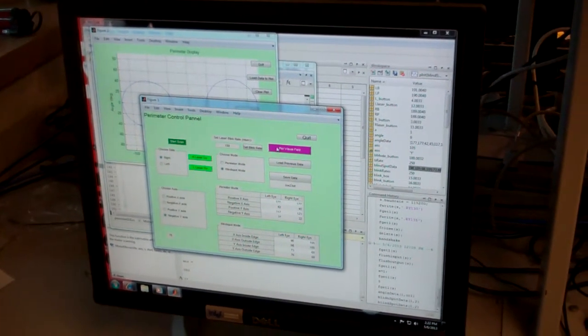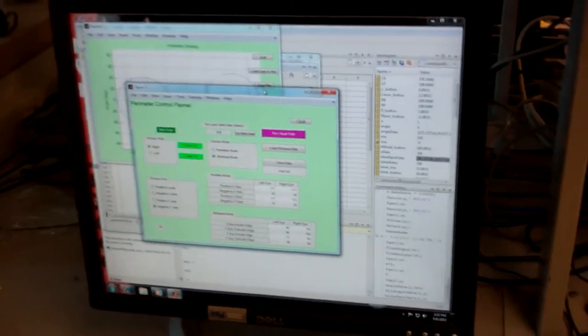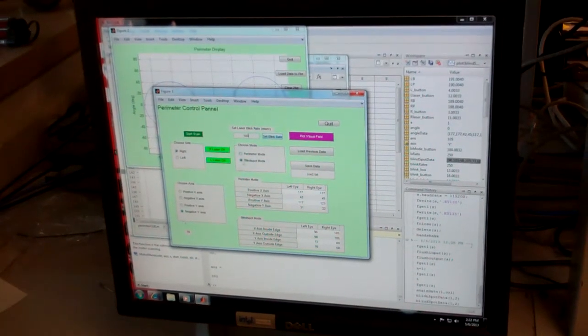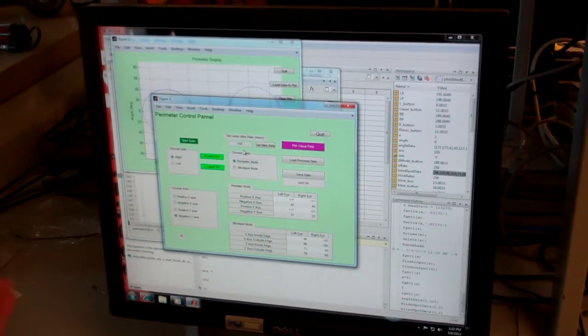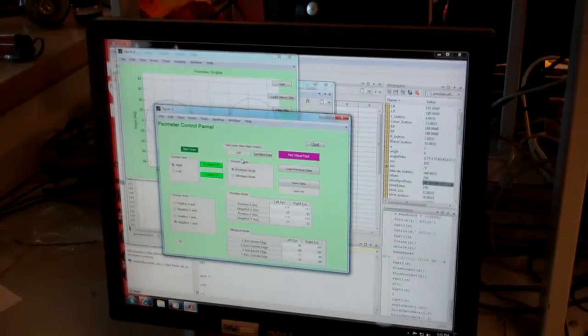Starting the data acquisition now with a blink rate of 10 times per second — this is the period in milliseconds of the blink rate. We're going to start with the right eye in perimeter mode. There are two modes: perimeter mode, which measures your peripheral vision, and blind spot mode, which maps out the locations of your blind spots.